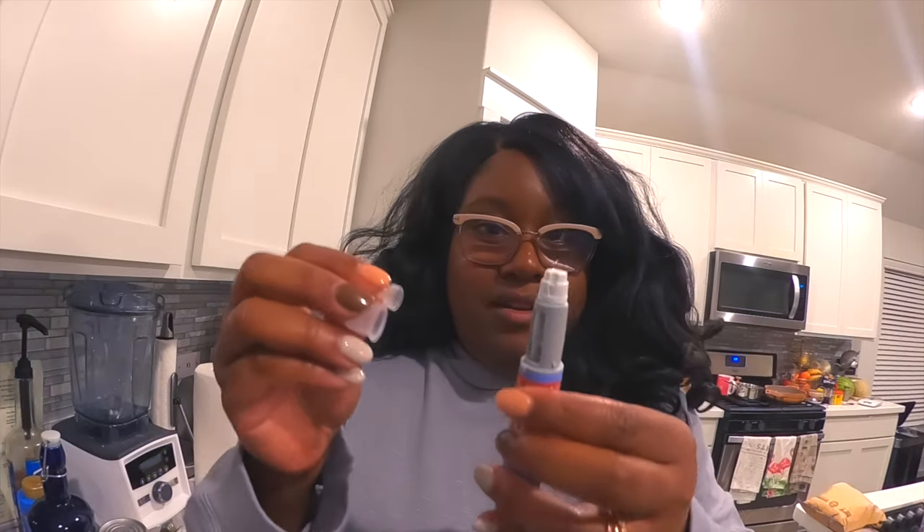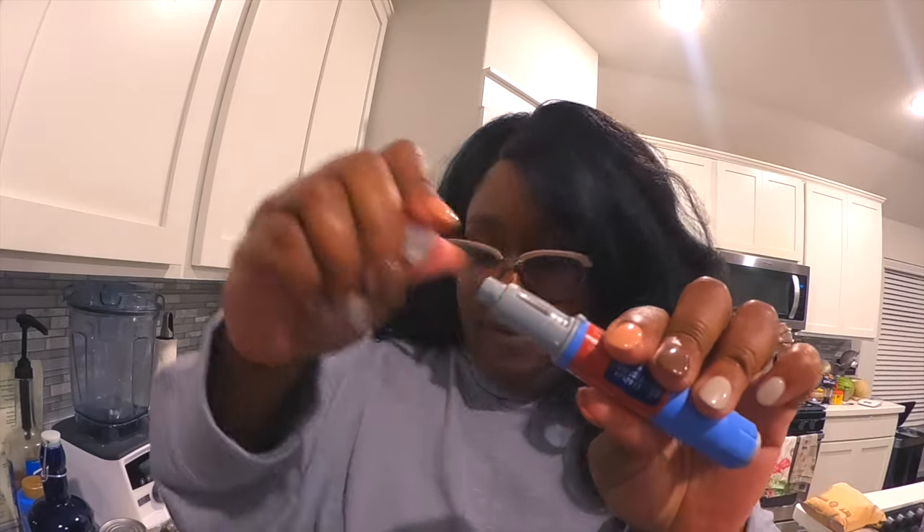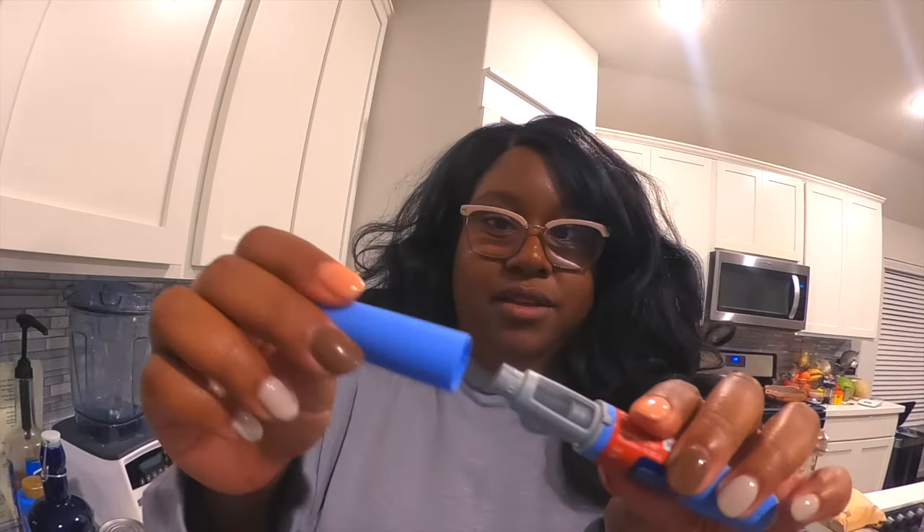Then that's it. Putting the needle cap back on, twisting it off, and then the cap goes back on and it goes back into the fridge. It is a pretty easy injection to take.